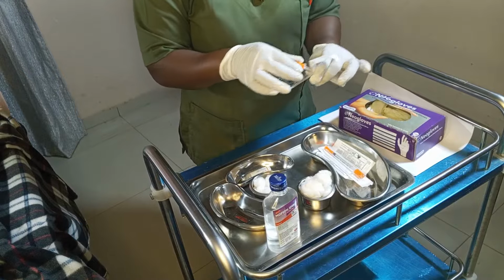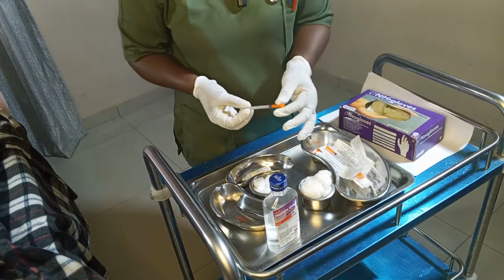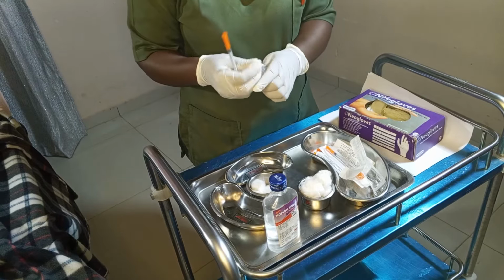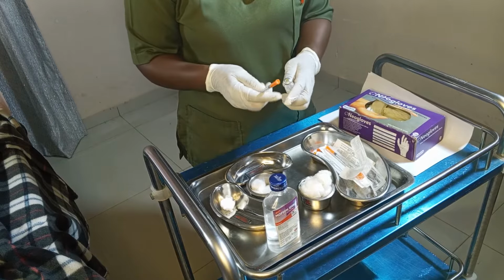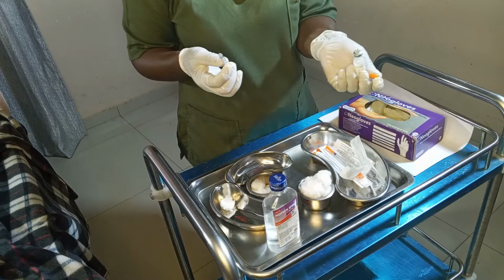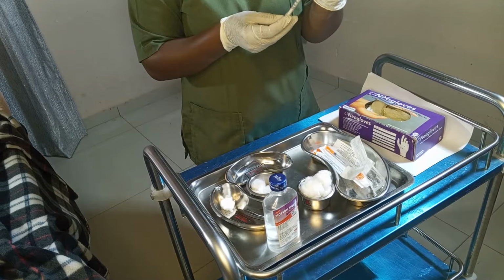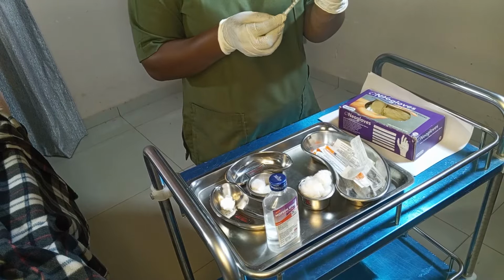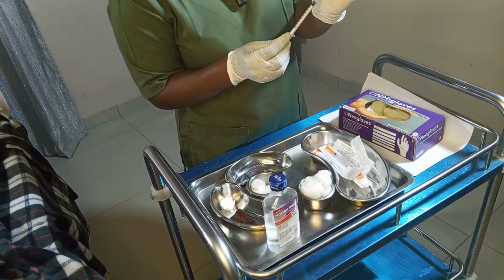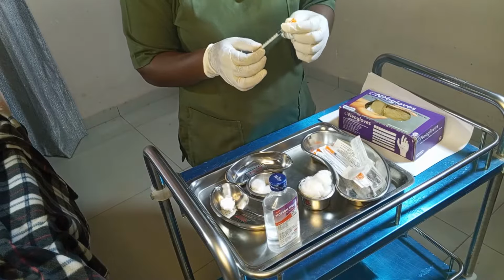So I have to remove and discard, and then also clean the tip with a spirit swab, discard the swab in a receiver, and then remove the needle. When you allow the tip to dry, then you will draw the desired quantity of units, right? The patient has been placed on 10 international units of soluble insulin. So I recap and place it inside the receiver.